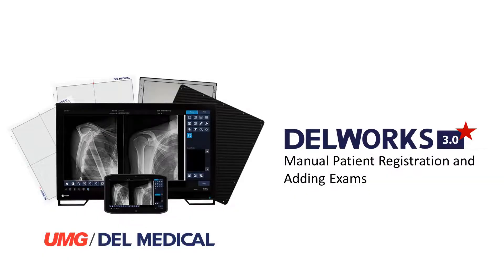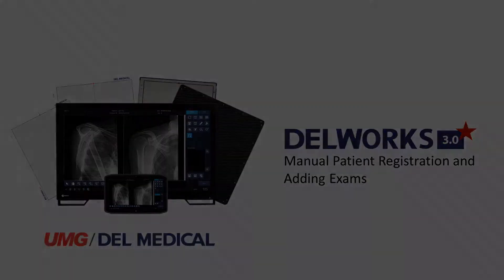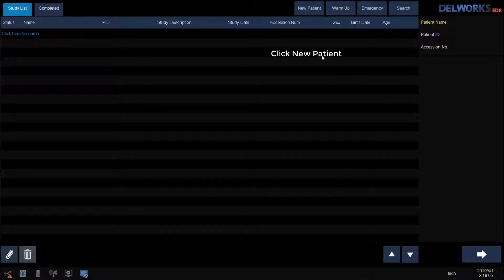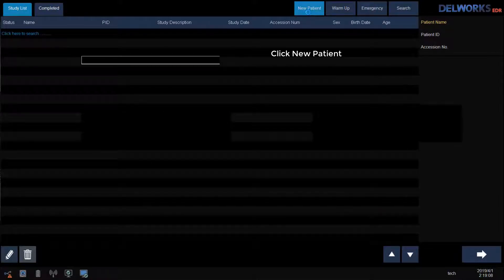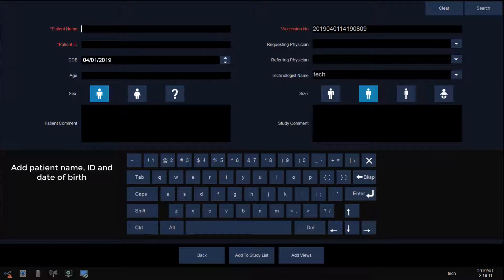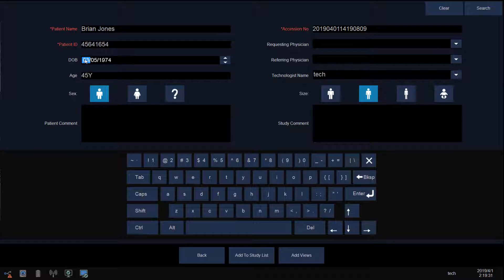If you do not have a predefined study list or modality worklist in your facility, I will now show you how to manually enter a patient and add their exams. From the study list, click New Patient. Enter the patient's name, enter the patient's ID, enter their date of birth starting with the year, and select their gender.